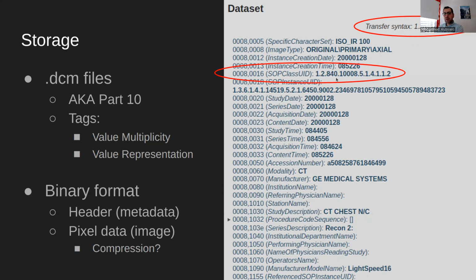And then the other thing in DICOM is this concept of UID. So it's a series of numbers that are separated by dots. These UIDs were basically invented in the 90s and are analogous to GUIDs nowadays. So nowadays, a lot of people are used to seeing these blobs of letters and numbers that are separated by dashes called GUIDs. UIDs in DICOM are similar, and basically it just stands for unique ID. So there are multiple value representations in DICOM. There could be codes, there could be short strings, there could be long strings. I'm not going to get into the details, but you get the picture.